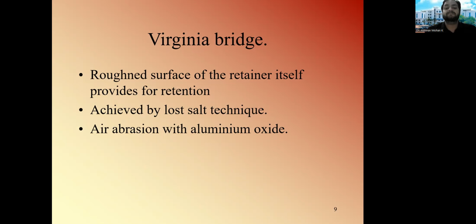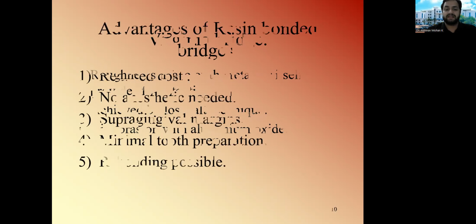And we do have a change in material. All these prostheses were being fabricated with acrylic or composite facings. Now we have even zirconia copings, which can be designed and CAD-CAM milled. We have all-ceramic restorations that can be milled and given in a single visit. And an adhesive bridge can be designed with the help of chairside economical restoration of aesthetic ceramic, that is CEREC, and it can be delivered.